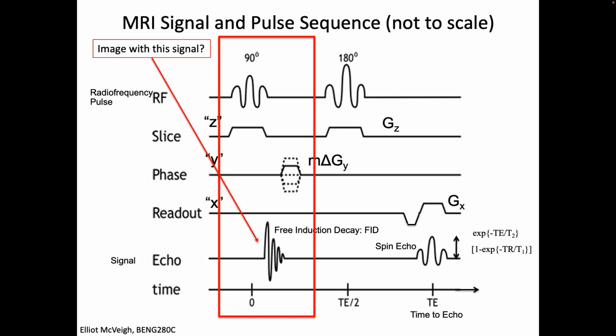Did you at least have earplugs or something? Oh yeah, you always wear ear protection in MR. There's never a time where you don't. You've got these yellow plugs in there.